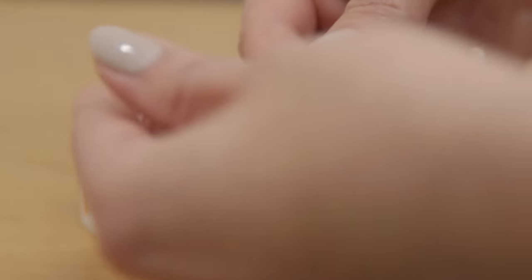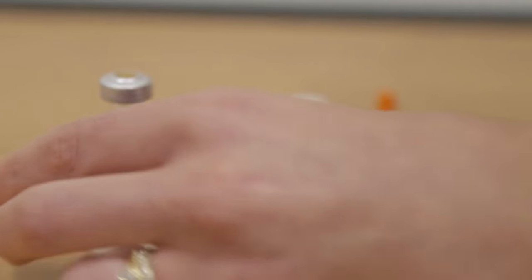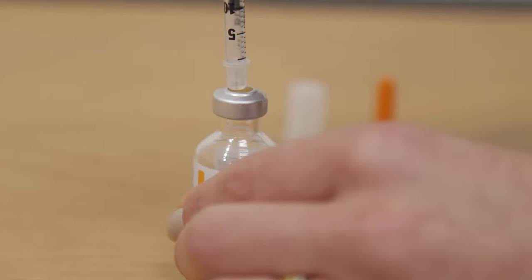Carefully take the orange cap off of the syringe. Both the orange and white caps can be thrown in the trash. Insert the needle into the rubber top of the vial and push that amount of air into the vial.